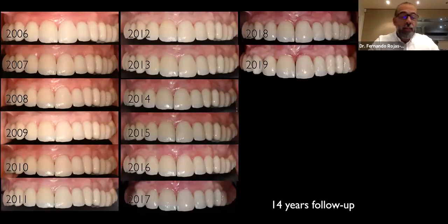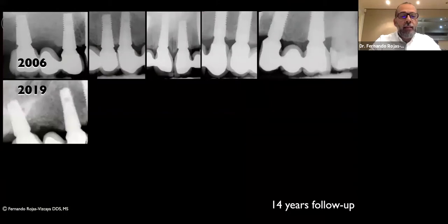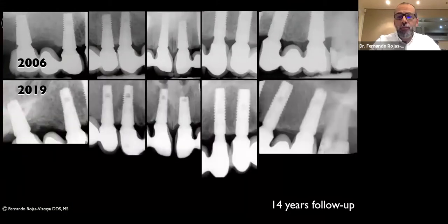In my last live workshop, I presented a 12-year follow-up of another case that was in the paper. You can check on my Facebook. I have the link to the paper where you can see the cases. Okay, this is at the delivery time, and this is after 14 years. Take a look, where is the bone? More or less a similar situation as in the lateral and in the molar.